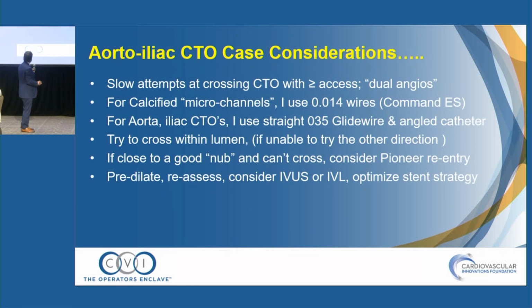And again, I'll just say that if it's a .014 calcified microchannel, that's where a .014 wire will cross very nicely. It's the only time I use it. Otherwise, you use pretty much straight Glidewires and an angled catheter. We try to stay within the lumen.